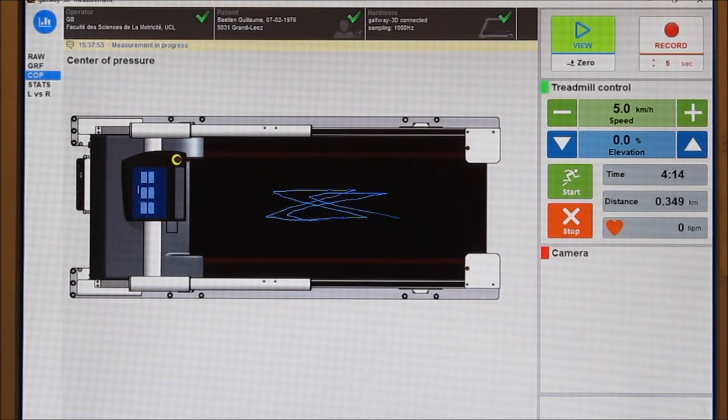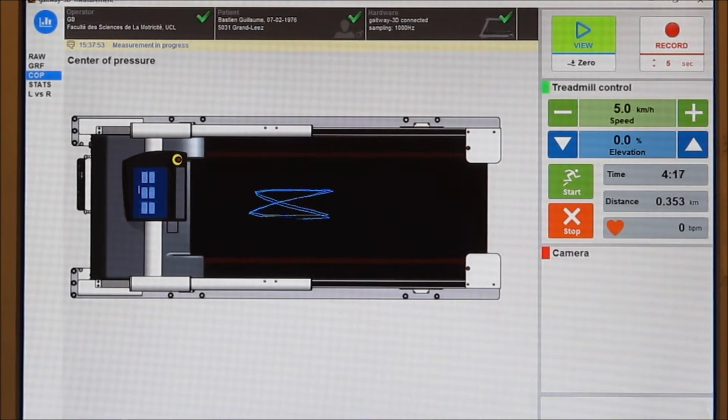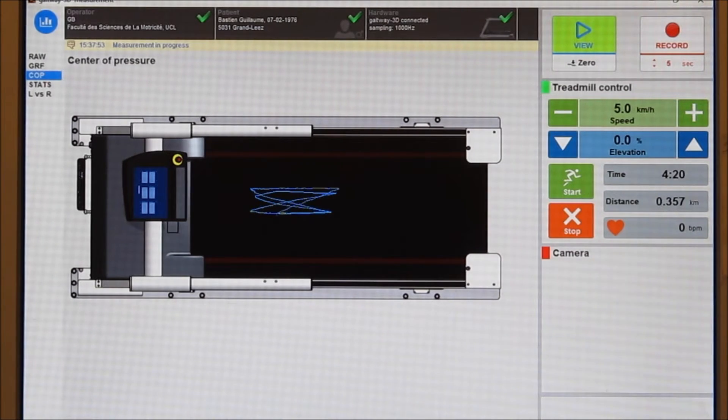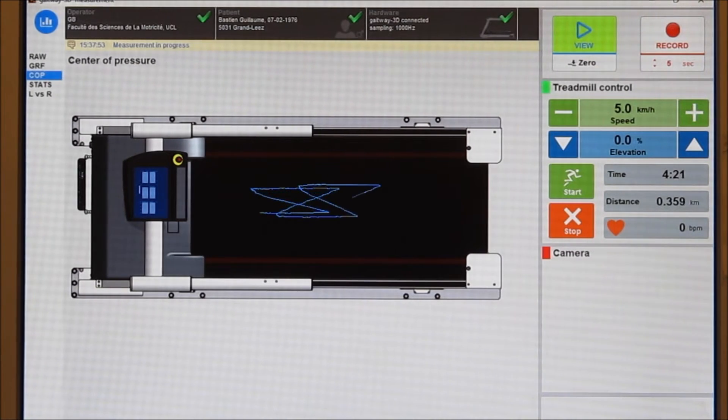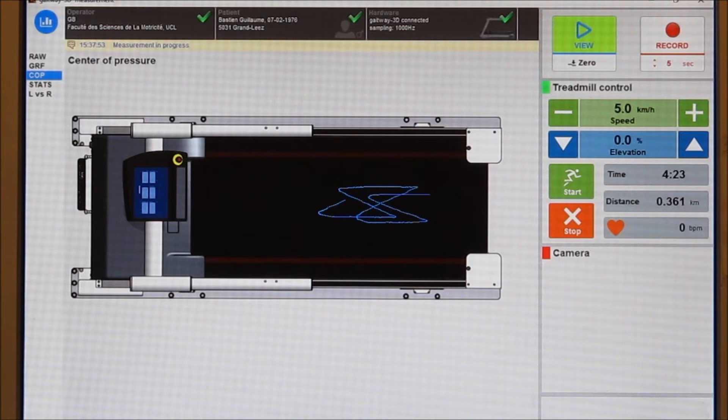The third panel shows the center of pressure. You can see the butterfly pattern on the treadmill surface and how the system follows the subject as he moves on the locomotion surface.